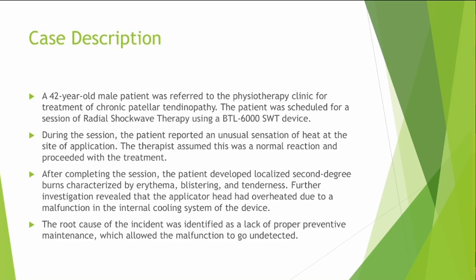After completing this session, the patient developed localized second-degree burns characterized by erythema, blistering, and tenderness. So after that, they saw that the patient developed second-degree burns. Further investigation revealed that the applicator head had overheated due to a malfunction in the internal cooling system of the device. So here's the problem actually.